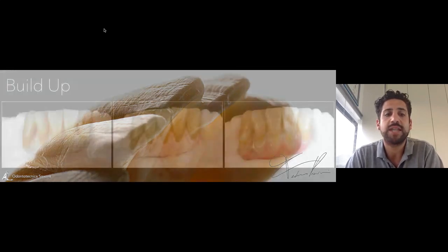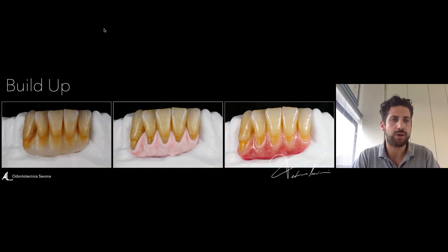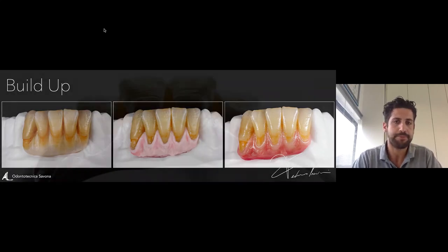This is some picture about the wax texture before applying the stains. And this is some step about the construction of the build-up. As you can see, it's the same protocol of our showcase that I showed you before. So first of all, I like to apply the stains. In the second stage, I like to make the build-up of the gingiva, and then we just go to polish by hand and some glaze. This is the final picture of our structure after the glaze.